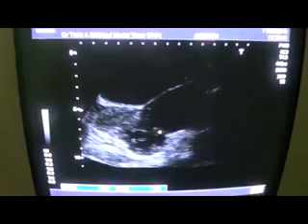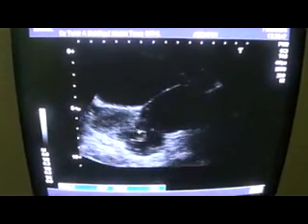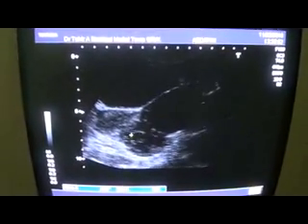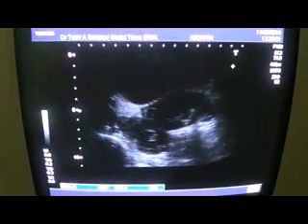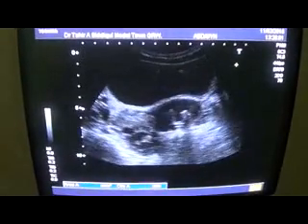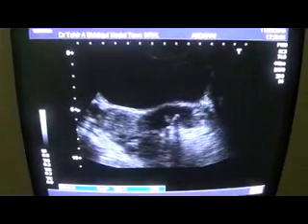Now you can see there are a few tiny cystic areas, septas as well. No complete septa seen. They are incomplete, thin septas in the dependent portion of this tubular cystic area. And here are the echogenic areas that we were seeing.